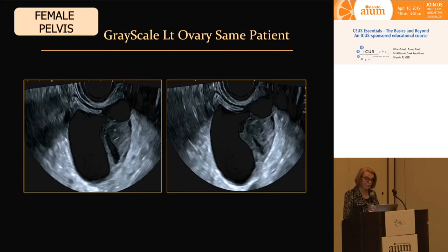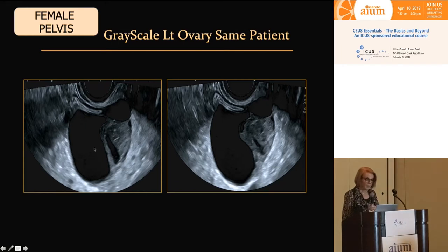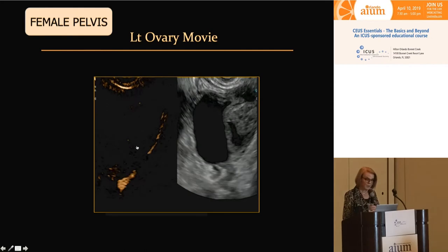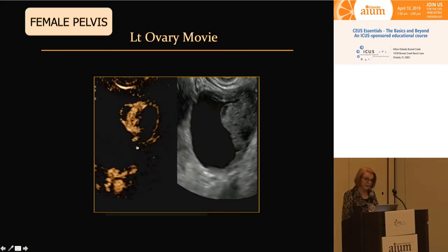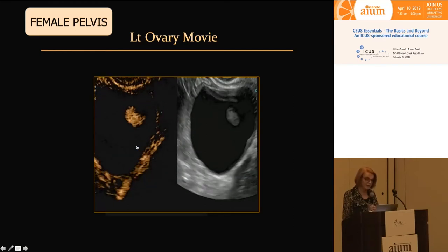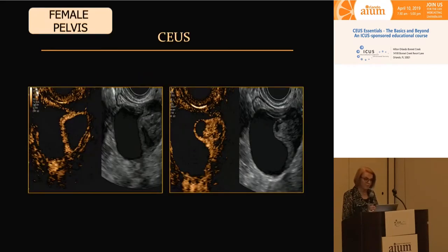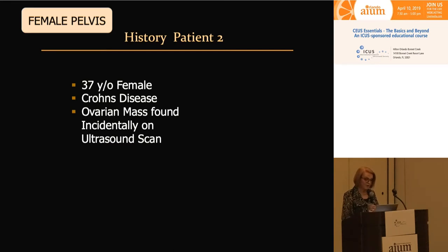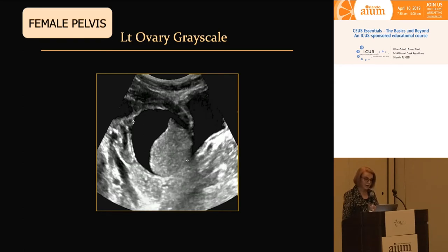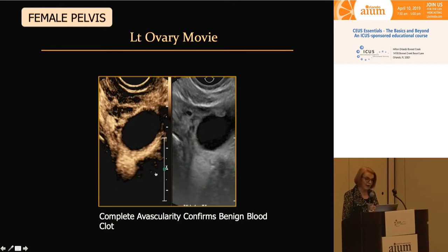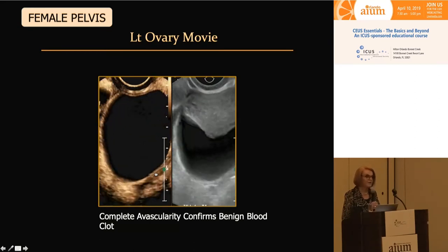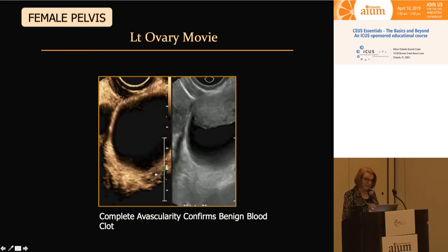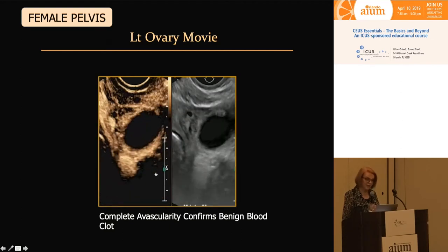Looking at the same patient's left ovary: we can see that part is cystic with a solid component. Although it's a very benign-looking grayscale picture, we were already injecting her bowel plaque, so we can see there's very little of suspicion in the ovary — just cystic areas with one large fluid component. Another patient also has an ovarian mass found incidentally on ultrasound. We're looking at an ovarian cyst with what looks on grayscale like a retractile clot inside. On contrast ultrasound, we confirm easily that the large mass lesion within the ovary is completely avascular — treated expectantly as a resolving hematoma within the ovary.